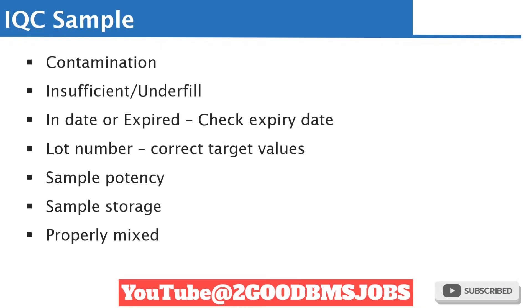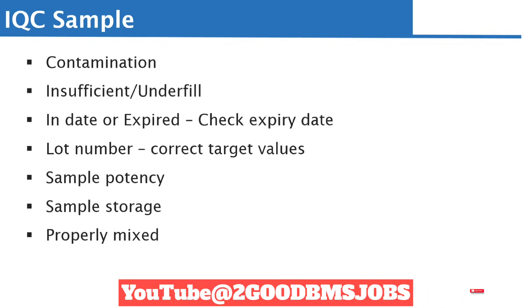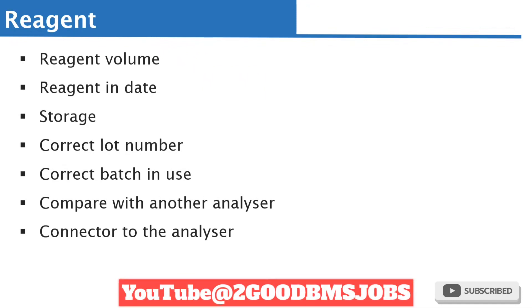Also check sample potency. Control samples have a validity period — some are valid for 24 hours, some 48 hours. If it is beyond its validity, you may need to get another vial. Another factor is storage temperature: has the control sample been stored at the appropriate temperature, or was it stored outside the recommended temperature? One factor many people miss is whether the control sample was properly mixed before running it on the analyzer — that can also lead to failure.